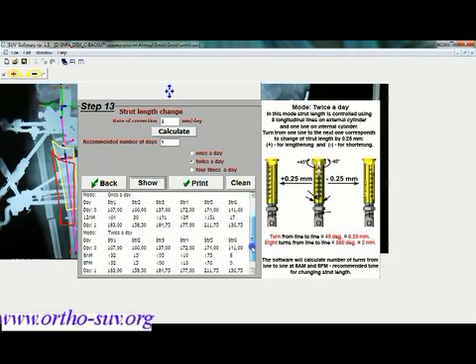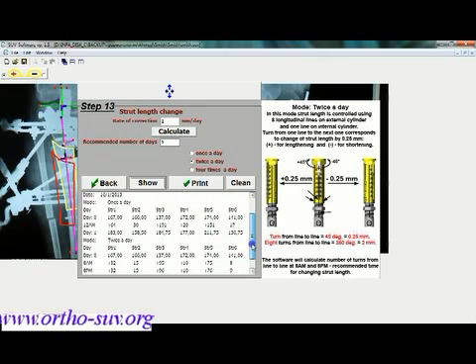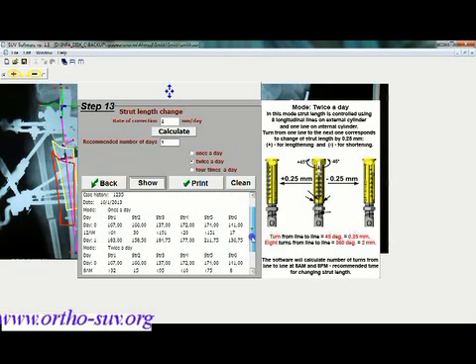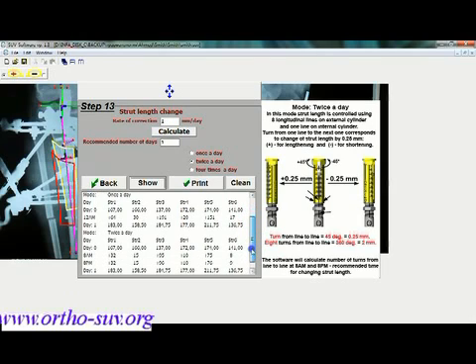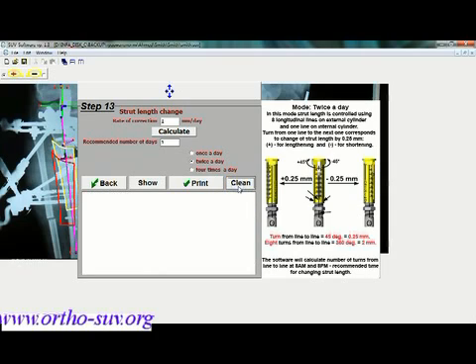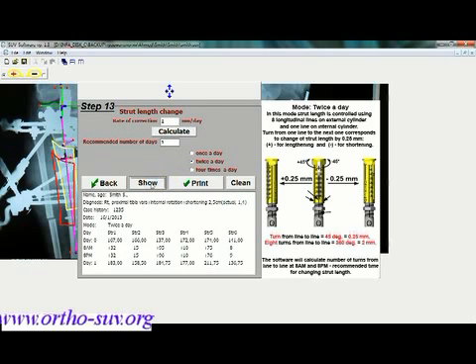If you did not clean the field and click the show button, the schedule will overlay the previous one and will appear a little bit lower. It's better to clean the field first and only after that click show button. You can also print the schedule and give it to your patient.